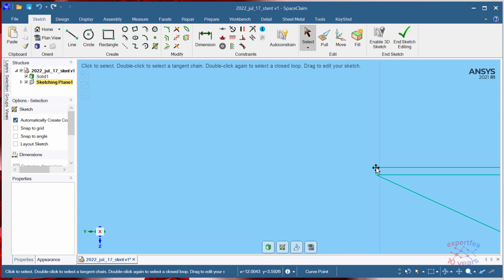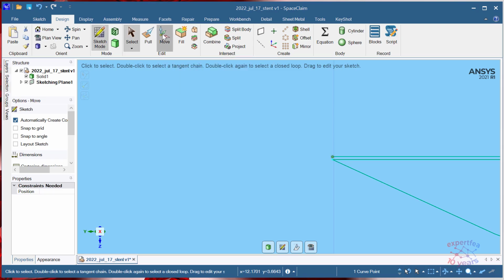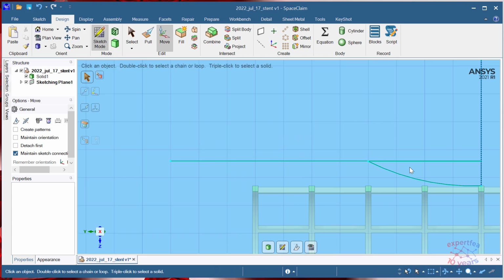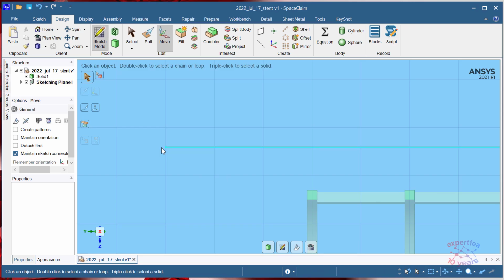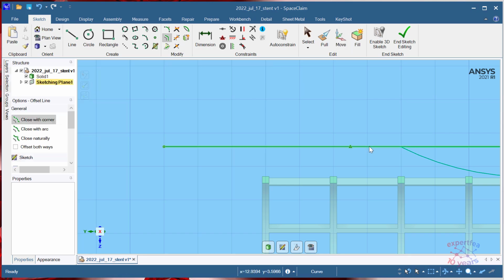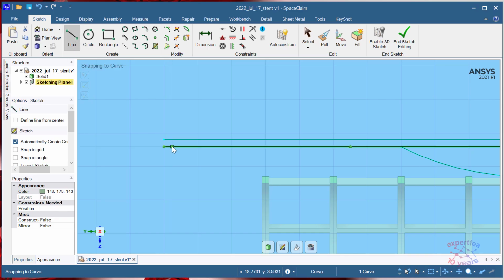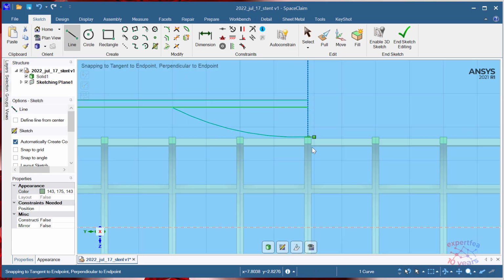Let's escape. Remember to hit escape to exit the command. I think we can move this a little outside. 7 mm would be nice. Yeah, you understand? So here is half of the plaque, and now we're going to obtain half of the blood vessel, let's say. Let's offset 0.2 thickness, yes, why not? And here we're going to close the blood vessel. Yeah, so we have half.